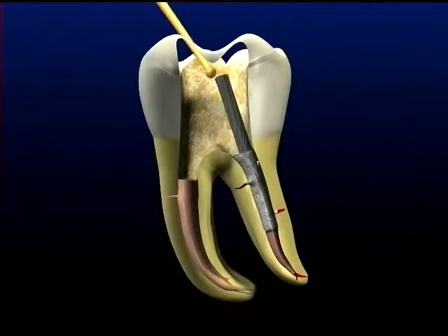This animation depicts the removal of a post using ultrasonics. With the coronal portion of the post already exposed, work begins with the ProUltra Endo Tip No. 1. This instrument is used initially at power setting No. 5 on the P5.